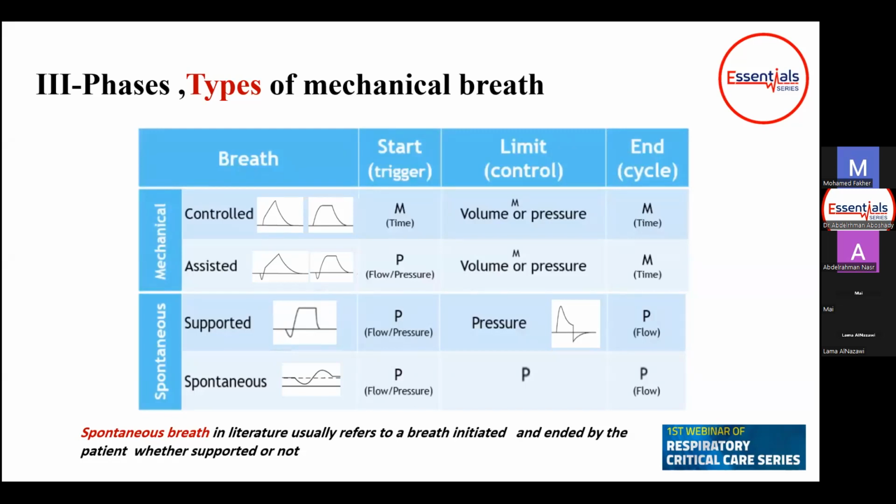This is very important when coming to the classification and to reading the literature about ventilation, because when we refer to a spontaneous breath in the literature, we mean supported and spontaneous, not only spontaneous.